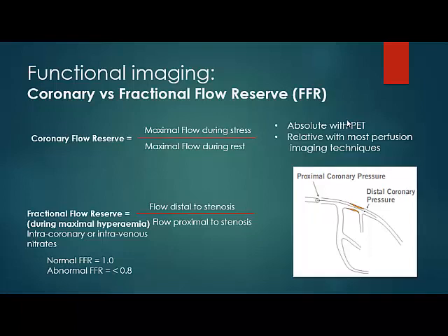Okay. That's important. In the cath labs, now we are using what is called fractional flow reserve. And that's become a very important tool to assess the functional significance of stenosis, particularly a moderate stenosis. Okay? So the patient has an angiogram, and the cardiologist sees there's a moderate stenosis in the coronary artery. So what does it mean? Is it causing functional reduction in blood supply or not? To identify that, one can do fractional flow reserve.